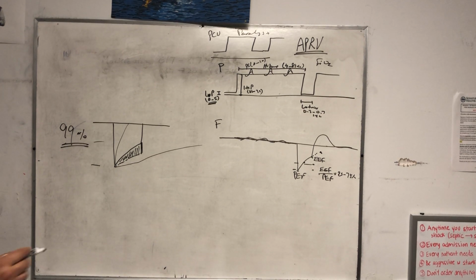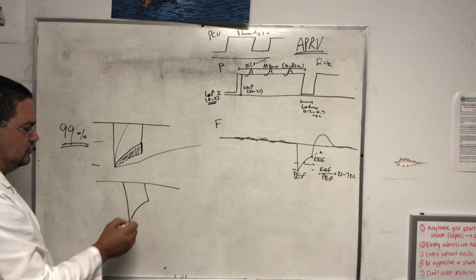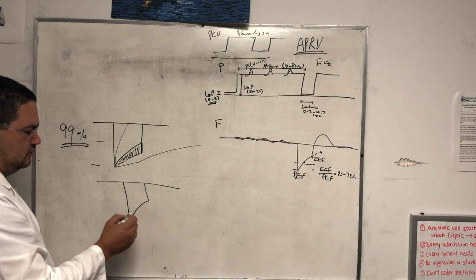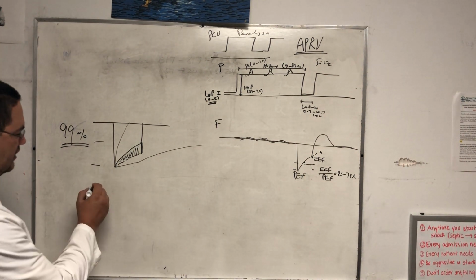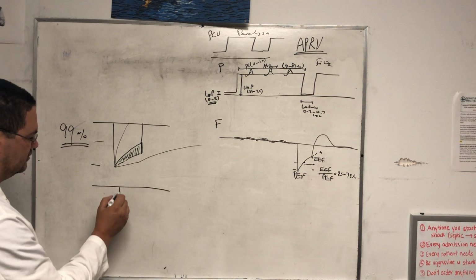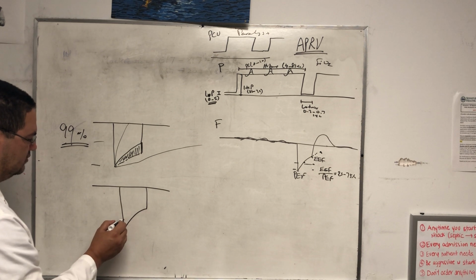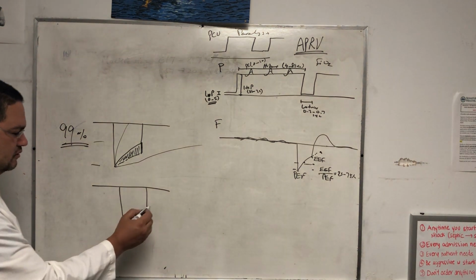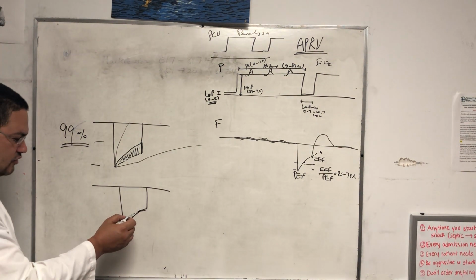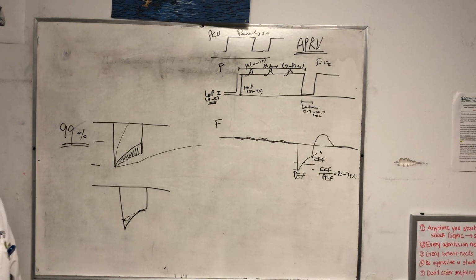Could be worsening, which is what? Remember this curve? Imagine if the curve is like this. Instead of the EEF increasing, the PEF decreased. This went to here, and this becomes the curve. So this is actually an area that is lost. This area here under the curve is lost. That means you lost tidal volume. That means you're not getting your tidal volume.